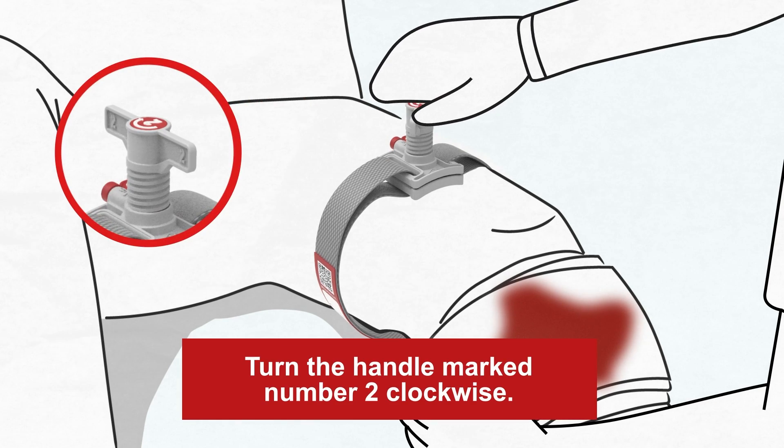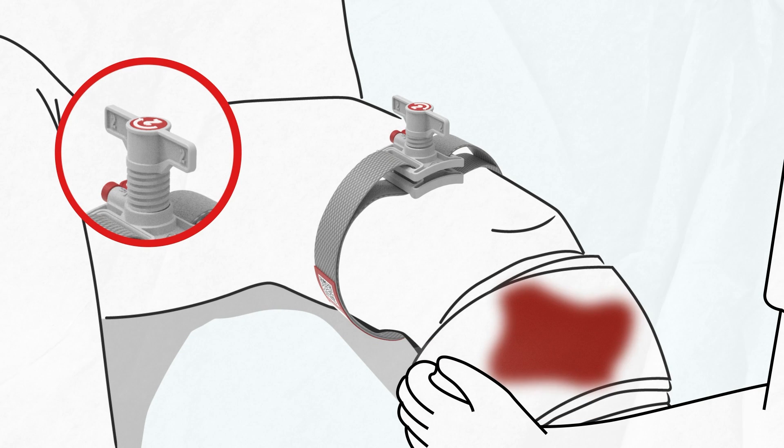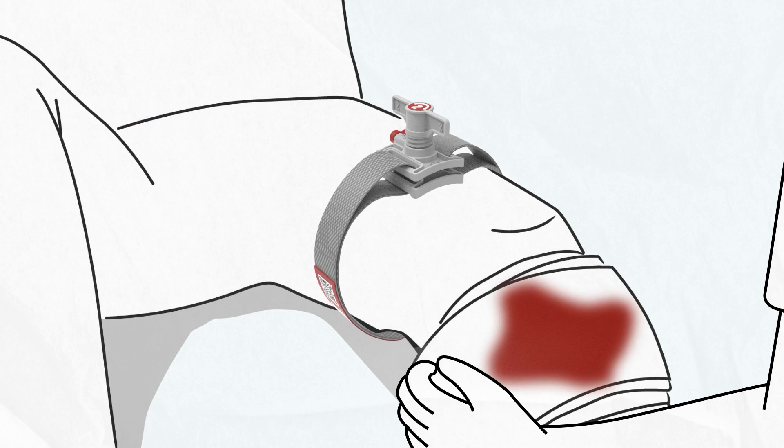Step 2. Turn the handle clockwise until the bleeding stops. This should only take a few turns if the strap is tight. There should be no pulse or bleeding below the tourniquet. If bleeding continues, check the strap. Retighten and apply a second tourniquet next to the first one if necessary.